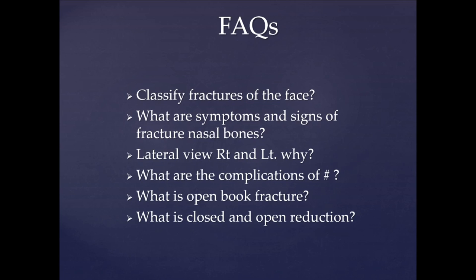So what is the instrument which is used for the correction of the fractured nasal bone? Which instrument will you use for the correction of the nasal bone fracture? Walsham forceps, sir. Yes, very good. What is your name?